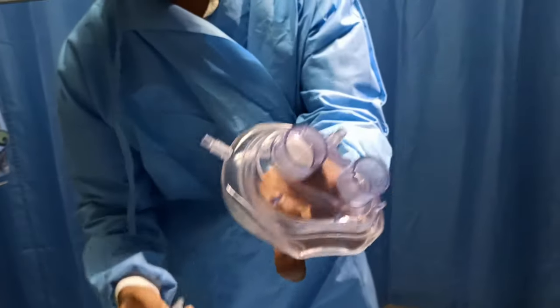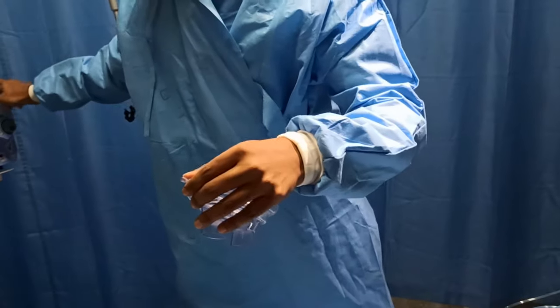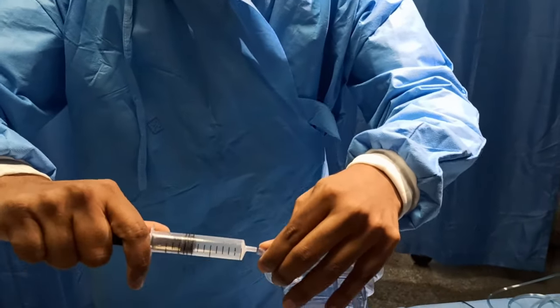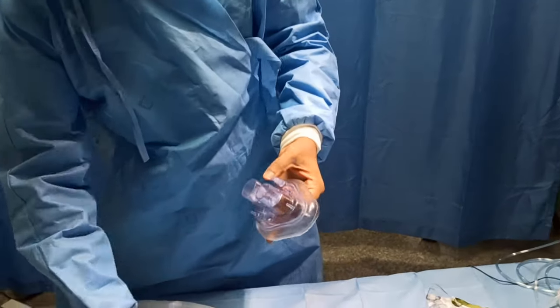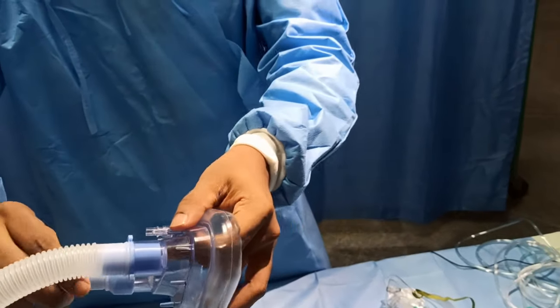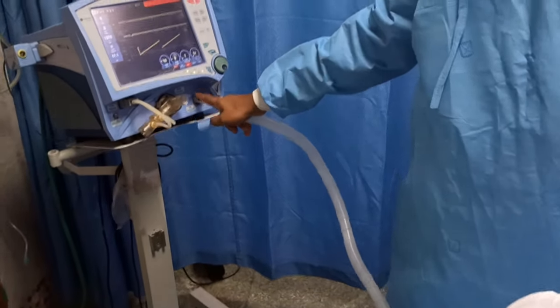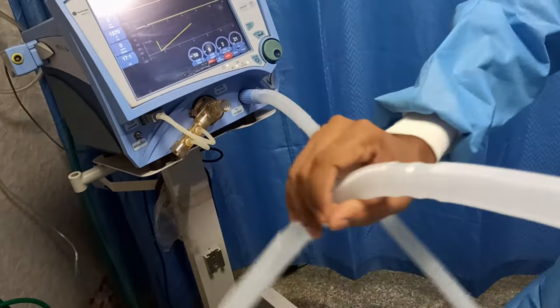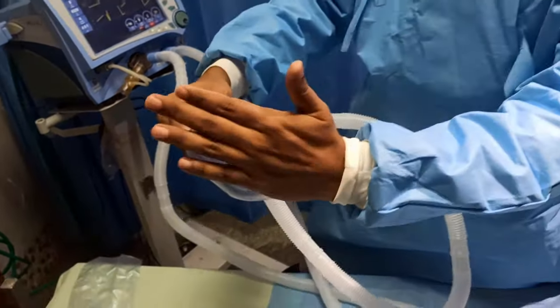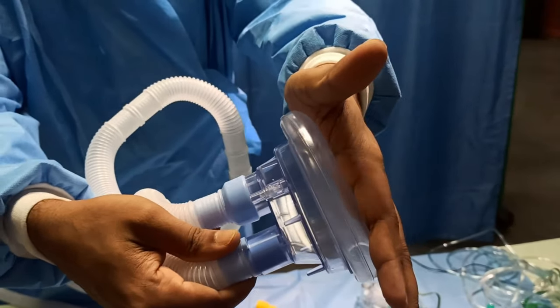First I will inflate this mask, because by default it is deflated. Take air and inflate your mask. Okay, this is the way to inflate your mask. Now it is inflated. Now just see how to connect. The inspiratory should be connected like this, and expiratory like this, and ensure this inspiratory tube goes directly to the patient port, that is the inspiratory port, and this expiratory side directly to the expiratory area. Okay, now you can see this started to work. See, the mask is also working. You can clearly see how the valves move inside.